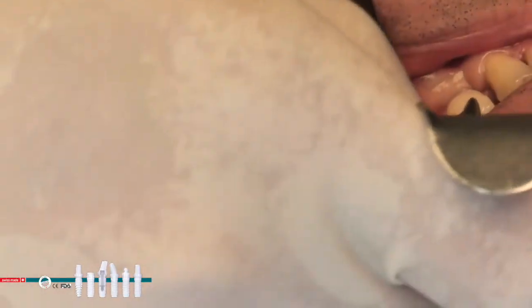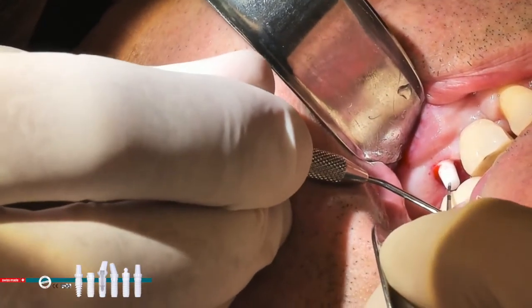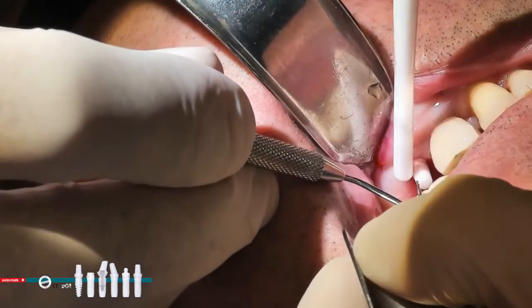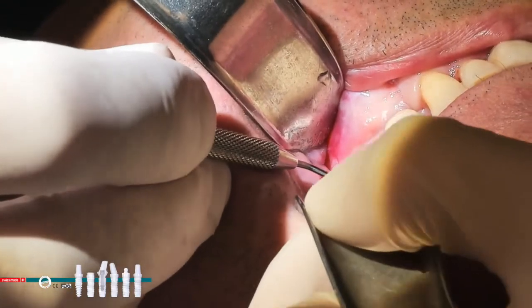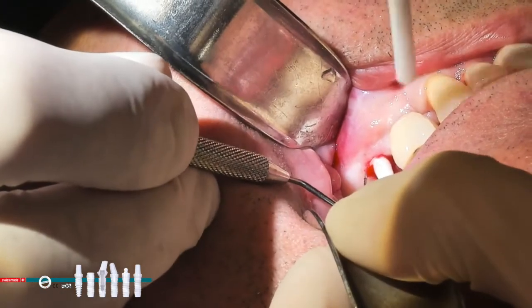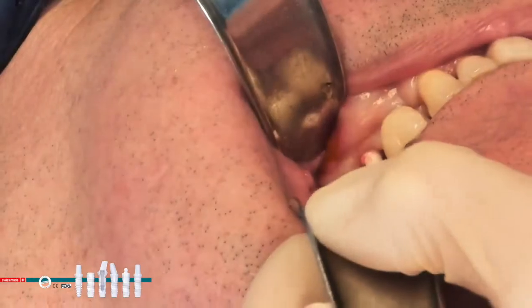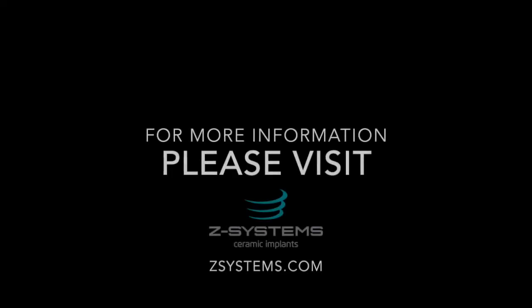And there is, hold this here please. And there is about 3 to 4 millimeters. Could you retract it down more towards his chin? 3 to 4 millimeters of clearance interocclusally. And that's what you need. You need about 3 millimeters of clearance if you can. It's beautiful. And it's flush at the gum line. The margins are right at the gum line. And very simple. Place it in. That was easy. It was easy. It's torqued to about 20-25 Newton centimeters, and we're done.